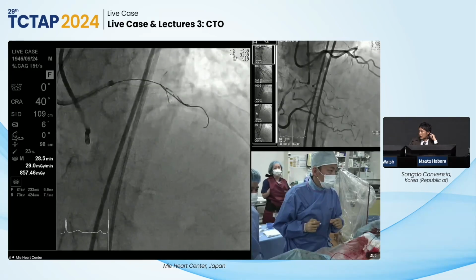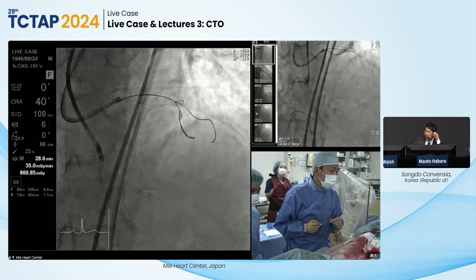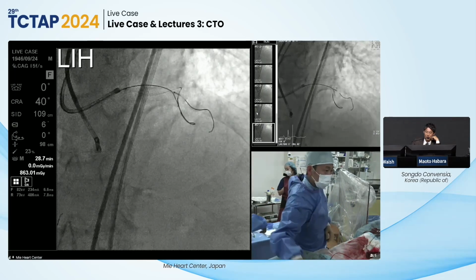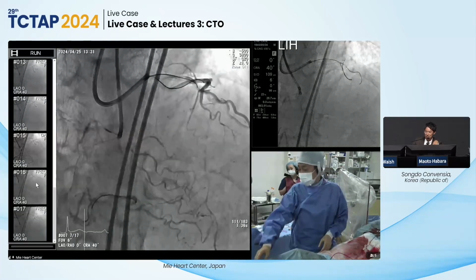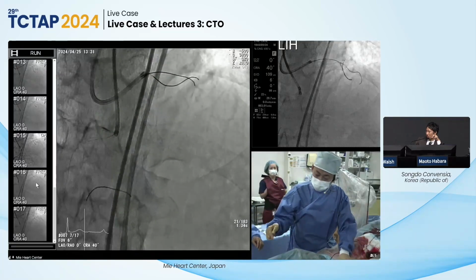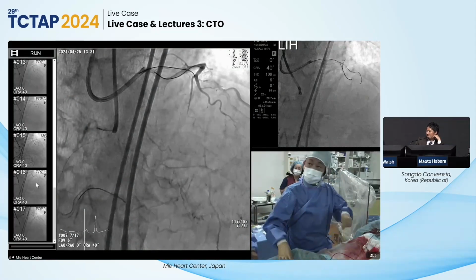And how do you make the choice? At retrograde, you mean, is it time? It's kind of, you get a sense when things won't go with it. But now, the guide wire looks not good. If this guide wire is completely finding another way to the distal target, it is time to change, I think. How do you think about it, Kambis? It's time to change.